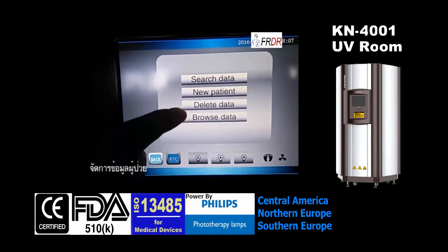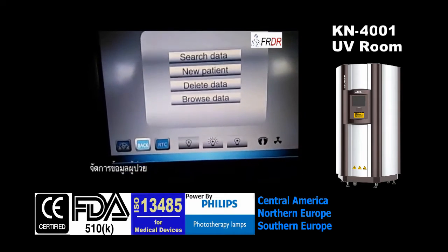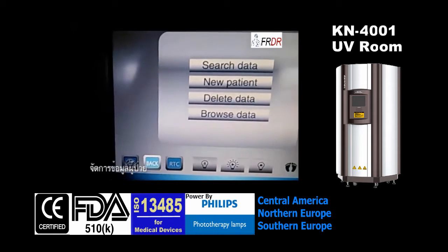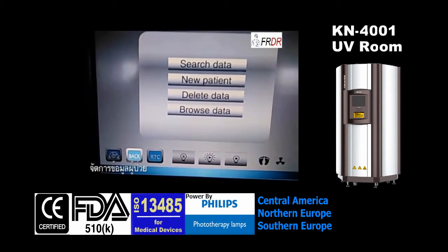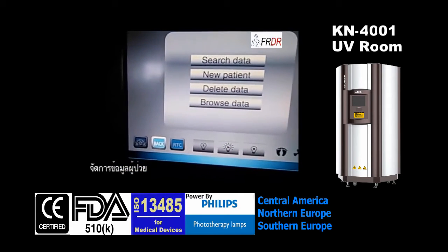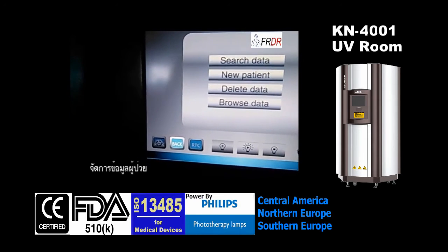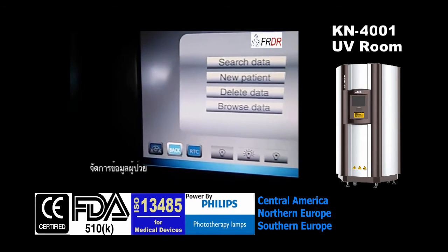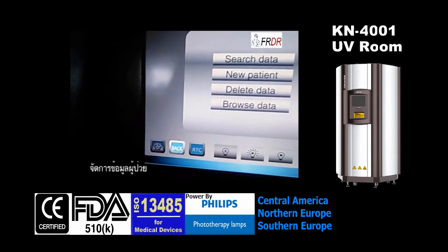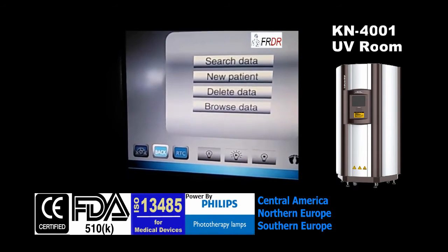This is data management. Every time a doctor checks the patients, the doctor might give the patient a report. Every time when the patient comes back, the doctor can search the patient's data by report number to see what dosage the doctor gave for this patient.